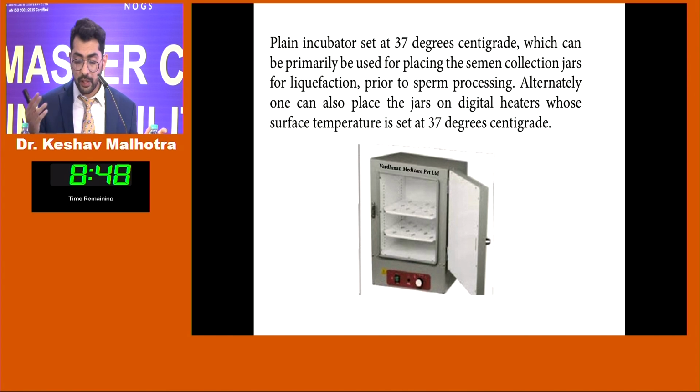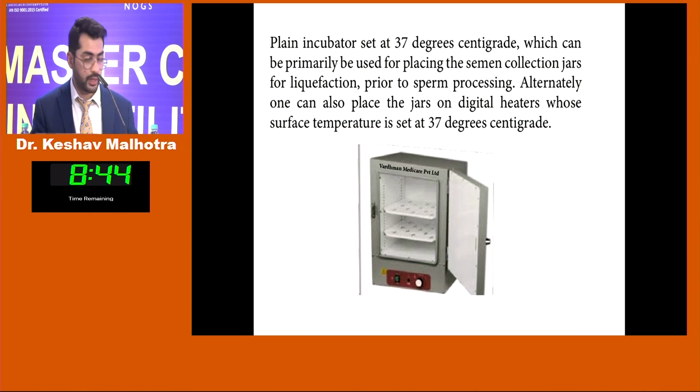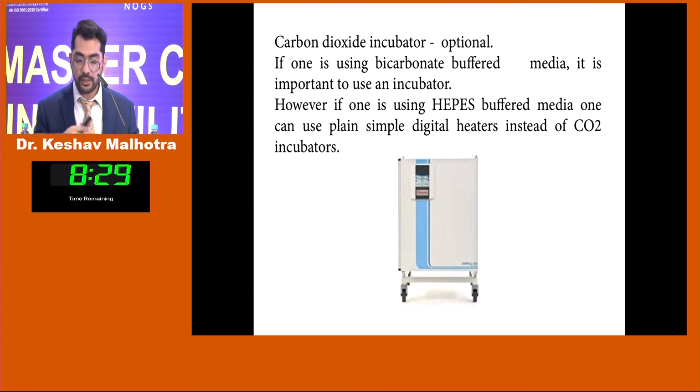Again, like I mentioned, an incubator can be utilized, but it's not mandatory, and these are the two kinds of incubators that are available. So this is an oven which only maintains the temperature. So in a scenario where you're getting a lot of samples in, this incubator will be used just to hold the samples in at 37 degrees till you start the processing. A CO2 incubator is of no use in the current scenario because whenever we are doing IUI, we are using a HEPES buffered media or HTF, which is human tubal fluid, as the main media that's being used for the IUI process itself, and that does not require CO2 to maintain its pH.